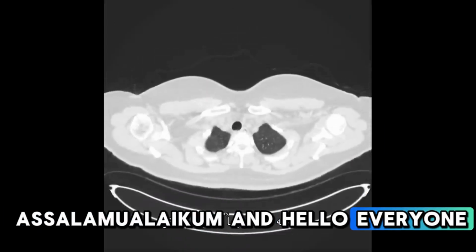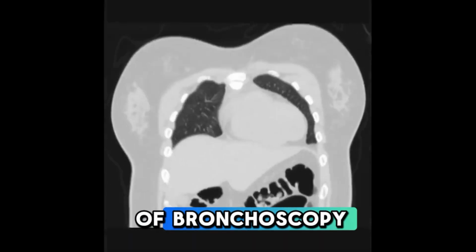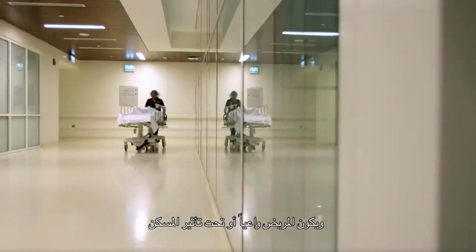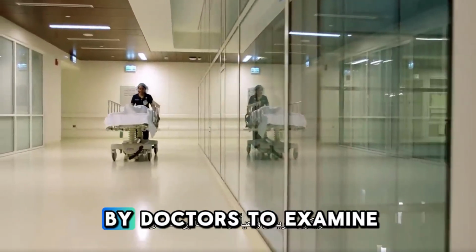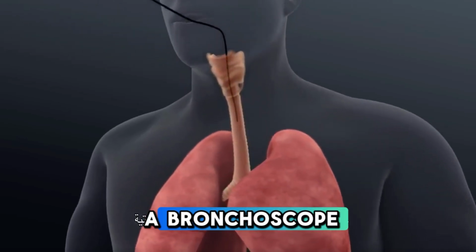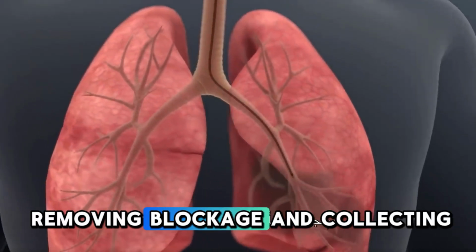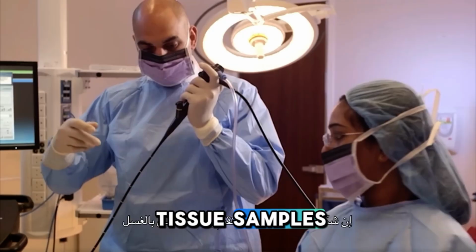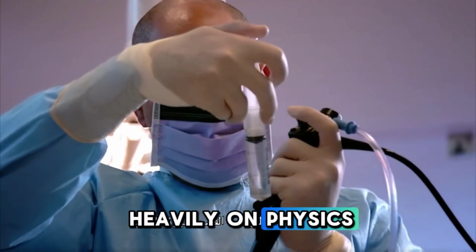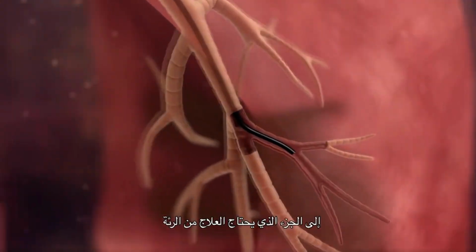Assalamualaikum and hello everyone. In this video, I will explain the application of bronchoscopy and how physics plays an important role in this medical procedure. Bronchoscopy is a technique used by doctors to examine the airways and lungs using a device called a bronchoscope. This procedure helps in diagnosing diseases, removing blockage, and collecting tissue samples. What makes bronchoscopy interesting is that it depends heavily on physics, especially in wave optics, mechanics, and fluid dynamics.